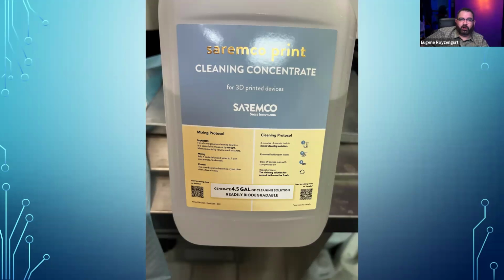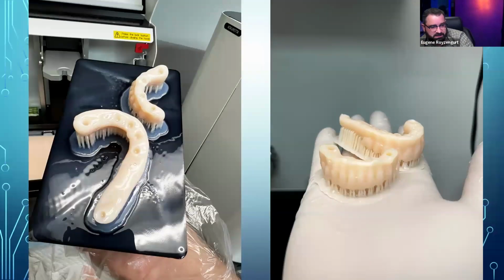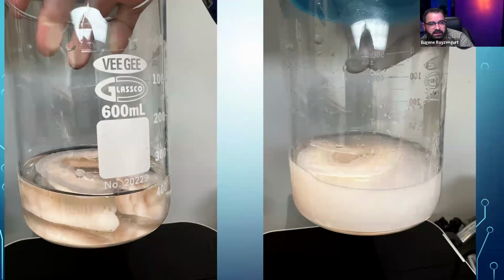So basically, you mix 4 parts of water and 1 part of cleaning concentrate. What I usually do is take like 50 milliliters of the concentrate and 200 milliliters of water, mix it together, and you need 2 batches. You need a clean one and a dirty one. So let's say we're doing a case right here. I place it in the dirty one first and run it for 3 minutes, cleaning it thoroughly with a brush. After that, I clean it under some tap water, put it in the clean one, and run it for another 3 minutes, cleaning it with a brush, and then wash it with tap water again, and then I dry it and then cure it.